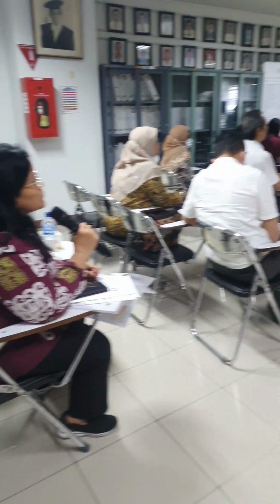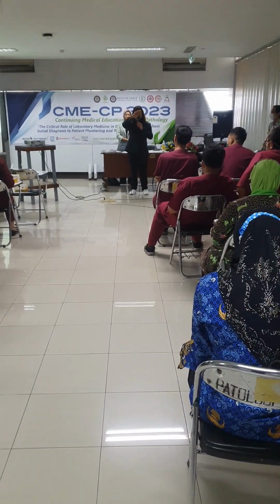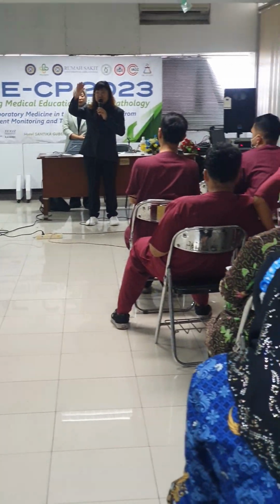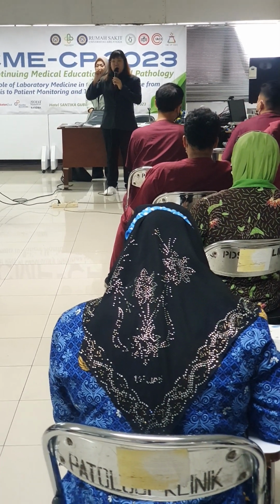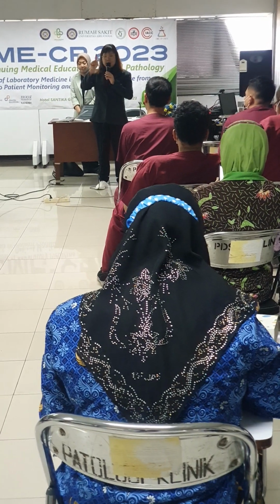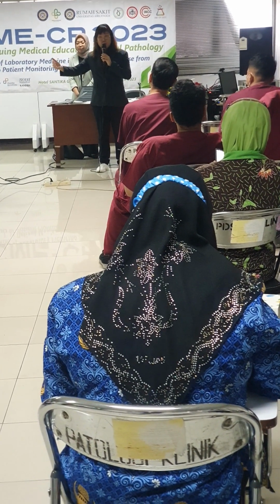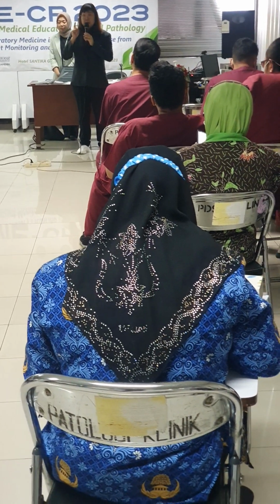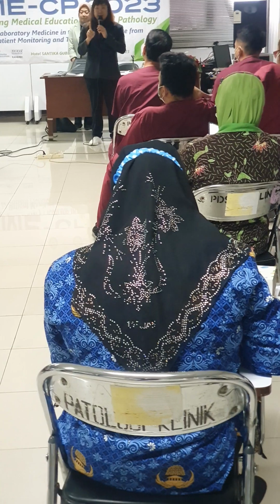Very good question, thank you very much. So right now, in the instruction for use, intended use, we have indicated less than 21 days of birth. So far, less than 21 days can be anywhere from 1 day old to 8 days up to 21 days. The most crucial is actually to test subsequently within 21 days.